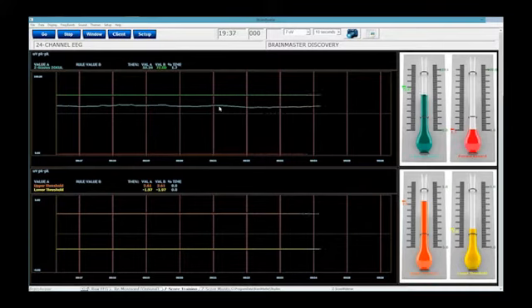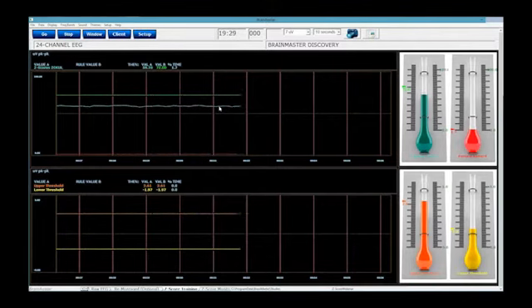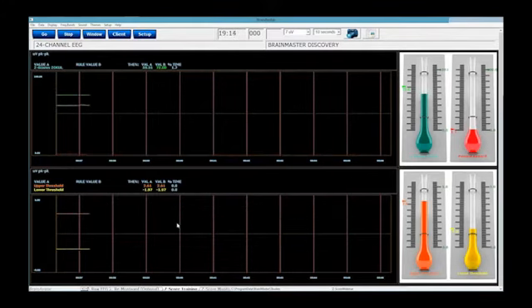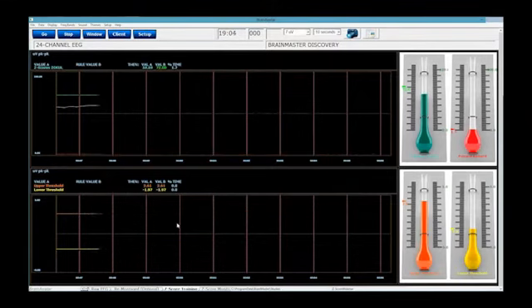There is a reason for that, and that is the amount of Z-scores we're really looking at. You're getting a lot of Z-scores going on. There's almost 5,000 Z-scores being computed right now, and it's basically asking what's going on within this range right here. Very, very powerful. But just notice that sometimes you're going to have a lot of Z-scores that affect it, and because of that, there's going to be a lot less play or jumping that you're going to notice. So if you see this nice even-keeled wave like you're seeing on my screen right now, that's normal. That's exactly what happens when you're looking at a larger amount of Z-scores.